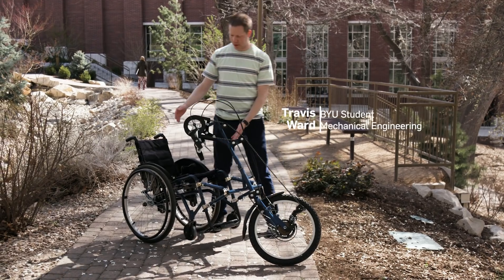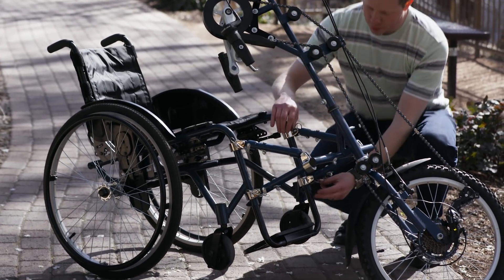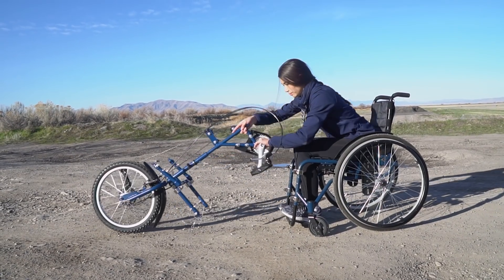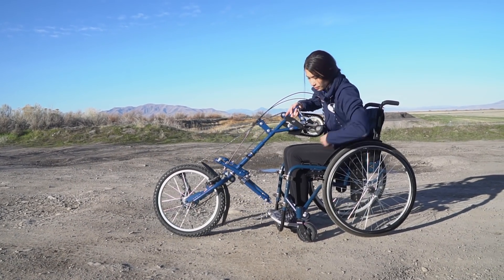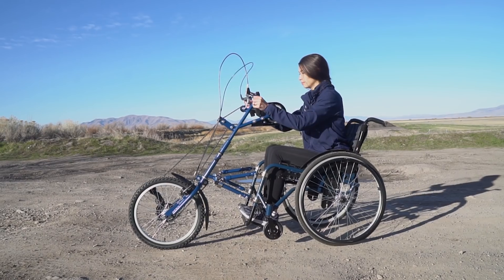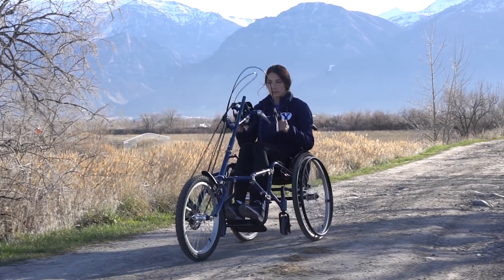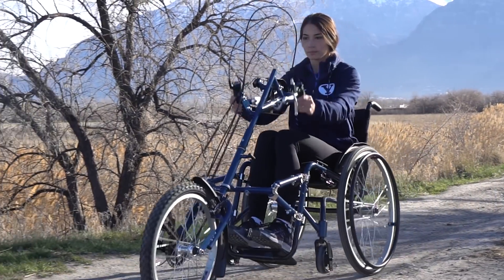Here's the trike — basically an LDS Charity wheelchair — and the goal is to attach the trike system to the wheelchair. The person will roll up to it, lift the attachment off the ground, set it down, and it will attach via pins to the brackets on the wheelchair. We're super excited about this project, and the trike attachment is going to work with a lot of different models of wheelchairs.